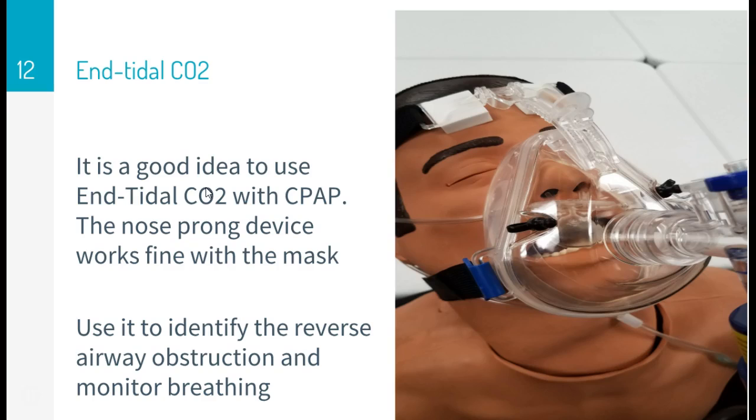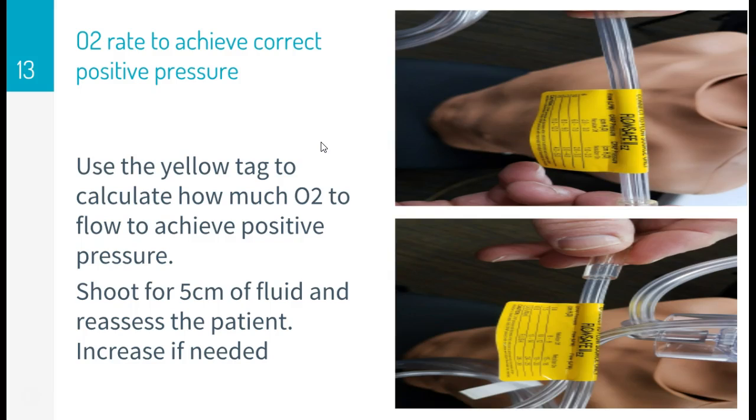You probably already have this on your patient to help diagnose your bronchospasm, looking for that shark fin. You can leave the end tidal right on your patient. You don't have to worry about this little gap right here. The way that the mask is designed, if you cinch it down, you're still going to get a good seal, even over top of the nose prongs. Definitely use a nose prong device here. You can't use the inline. It helps us to monitor patients' breathing, see if the waveform changes at all, watch your respirations. Good to keep monitoring your patient and reassessing them to see if your CPAP treatment is being effective.